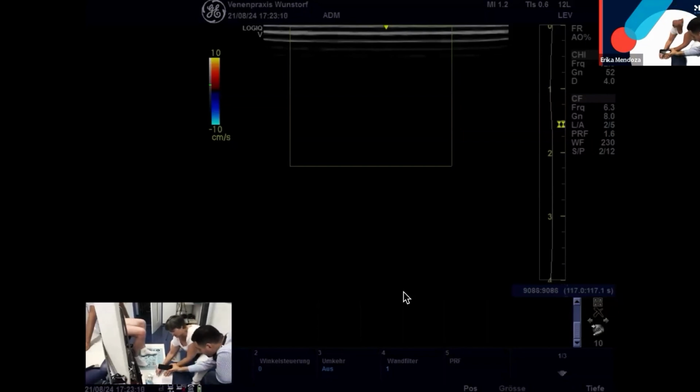Okay, so this is the deep vein in this patient. It goes upstairs, it's perfect. This is the terminal and preterminal region. Blood is going up. And you have the perforating vein bringing the blood outside. It connects to the saphenous vein, and instead of going down as we are used to, it goes a little bit up. The reflux goes upstairs, and then it goes into the tributary. So you have a small dilated segment of the great saphenous vein, which is flowing up.